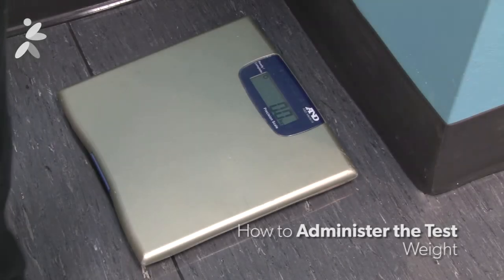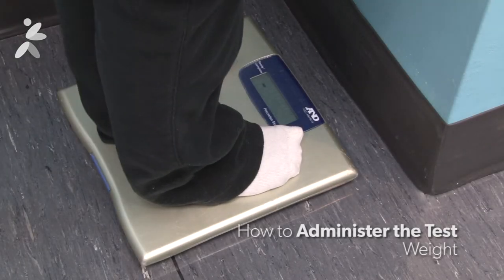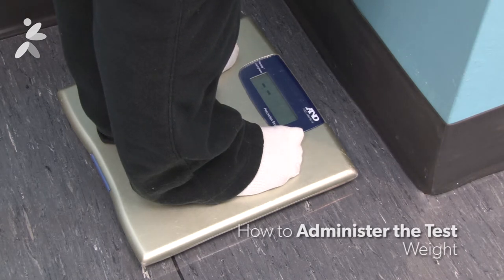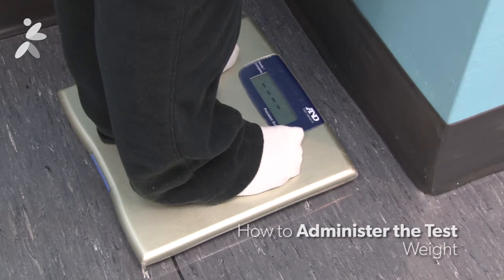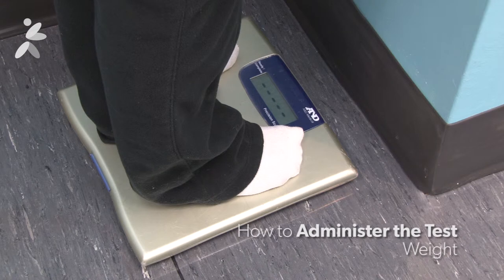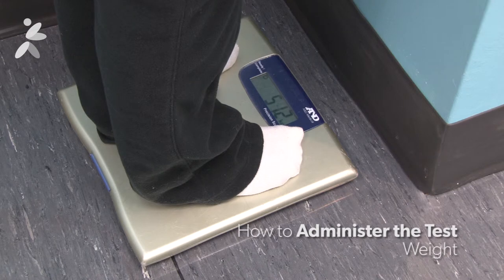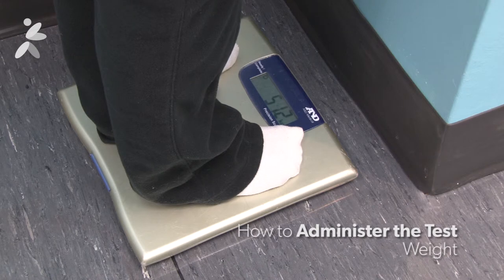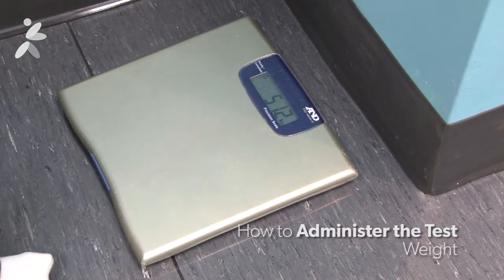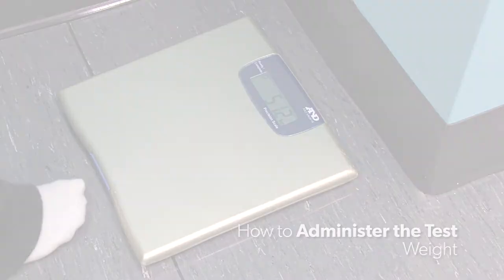Take one measurement if using a digital scale. For consistency, take two measurements if using a mechanical scale and use the average of the two scores as the final weight. If the two scores differ by more than 0.5 kg, take a third measurement and use the average of the two closest weights as the final score. Record the weight to the nearest 0.1 kg.